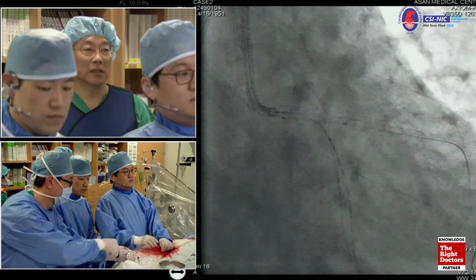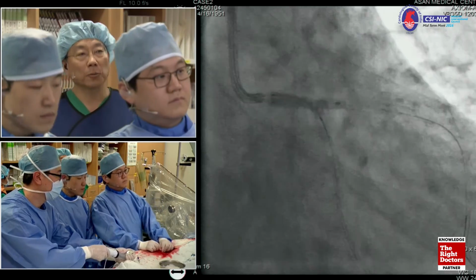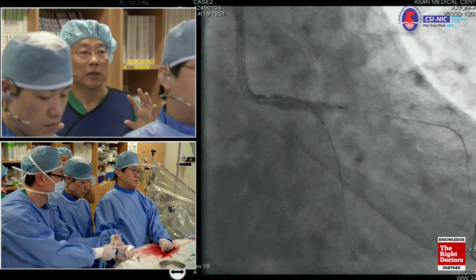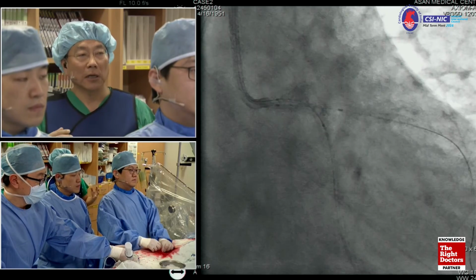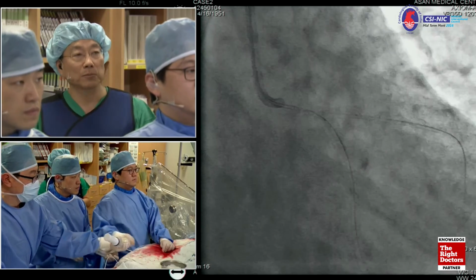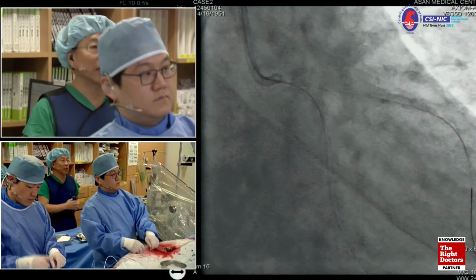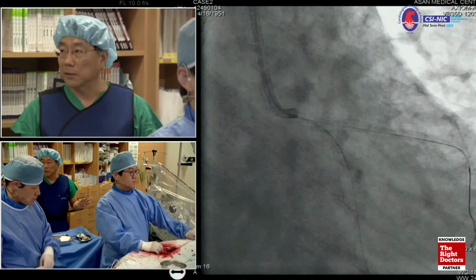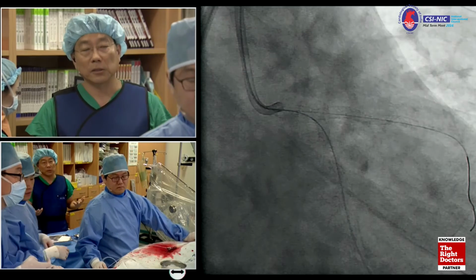I think we really enjoyed the cases, and I hope you all enjoyed these 2 cases for the main intervention. Because the main issue is actually we prefer IVUS-guided procedure, right? Before and after the IVUS-guided procedure, measuring the stent cross-sectional area is the most important predictor for late outcome. That is our message from the 2 cases. And whatever you choose, the 2-stent technique, I don't worry about that. Still, the single stent is good rather than the complex 2-stent procedures.